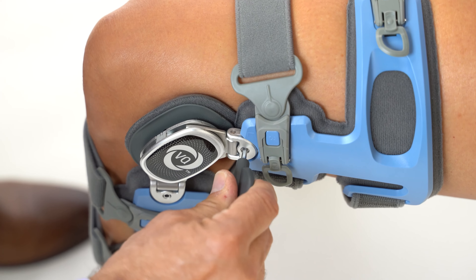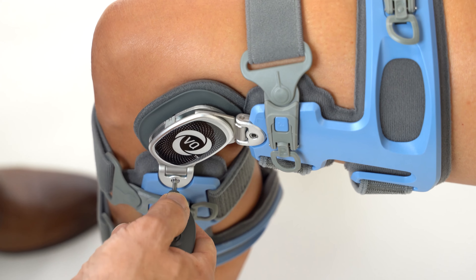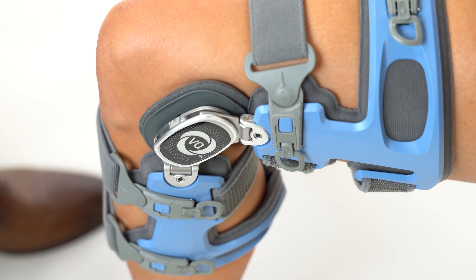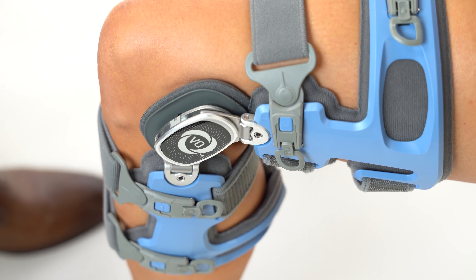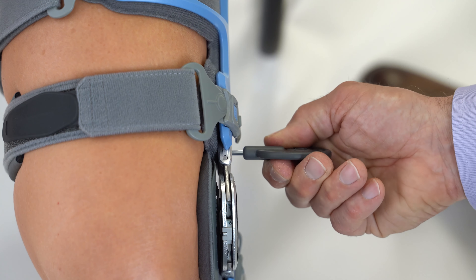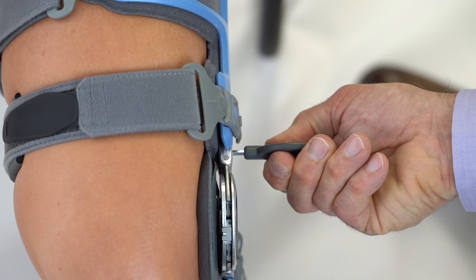If there is any discomfort in the knee joint or leg, turn the angle adjustment back slightly. If more relief is required, turn the upper then the lower Q-hinge screws no more than one-eighth turn. Over-adjusting the Q-hinge may cause discomfort, rotation, or skin pressure issues — adjust conservatively.